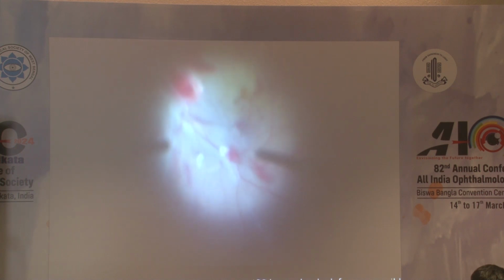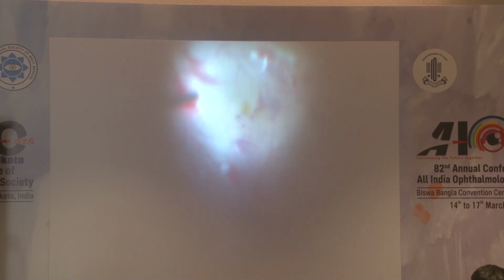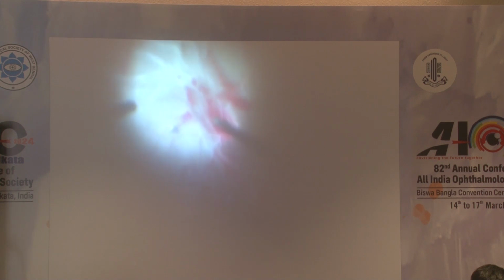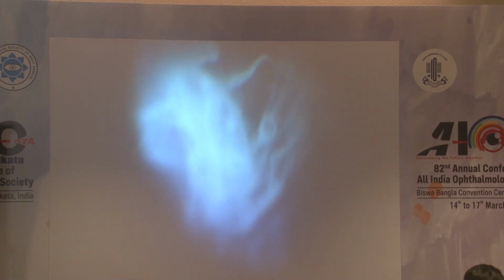These bleeders now have to be cauterized in order to avoid loose blood in the post-op period. Looking for bleeders elsewhere, you can decrease the pressure also to zero and see if there are any oozers present. Now, since we cannot find any bleeders or oozers, a triamcinolone wash at the end of the case is essential to see if there's any posterior cortical vitreous remnants to avoid any traction in the post-operative period.